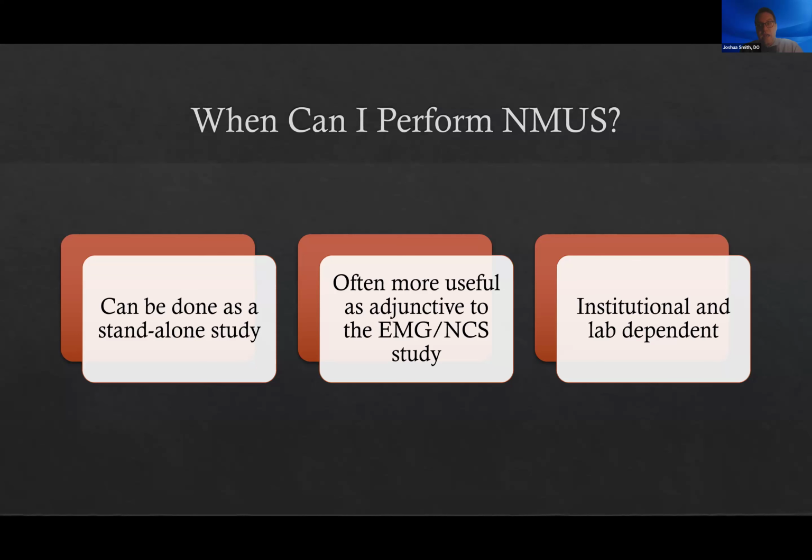Usually they've already had the nerve conduction study and EMG done, and I'm looking to add a little more information, a little more expertise to help me better care for them. Then I will just grab the probe and do it the same day, same time. They get three tests all at one time. You might think, well, that's a lot. But by the time they've had nerve conduction and EMG, an ultrasound is easy. It's cool gel and pictures. Usually it's a little interactive and patients like it.